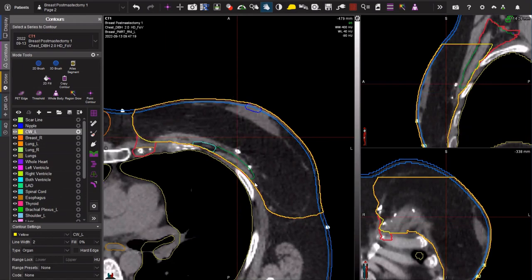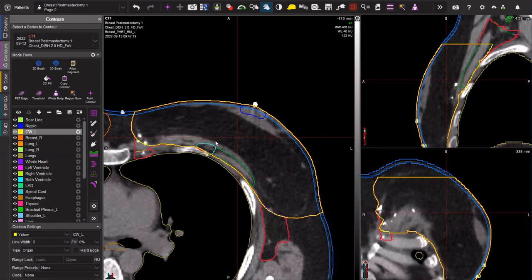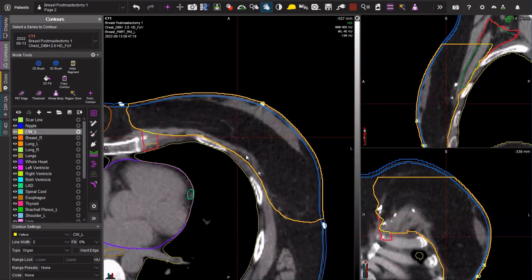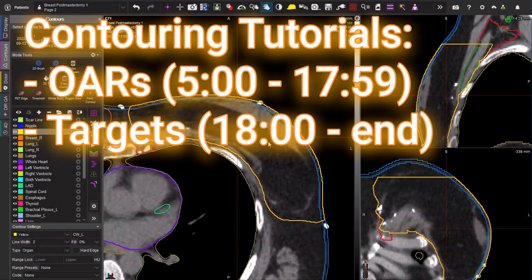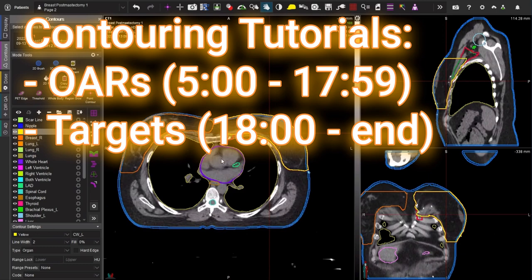You'll see that there's some overlap with your level 2 and level 3 lymph nodes — it's a little bit redundant. I've contoured them here just so you can see how they're supposed to look. At the end of the day, whether or not you've contoured them, as long as you have this posterior space covered where you're going to the edge of the chest wall, that's what matters for your patient. So let's go over some of the other structures, our OARs, and then we'll dive into talking about the target structures themselves.